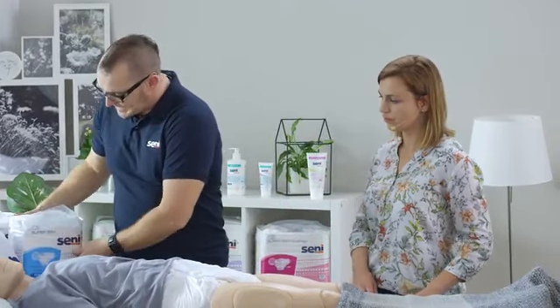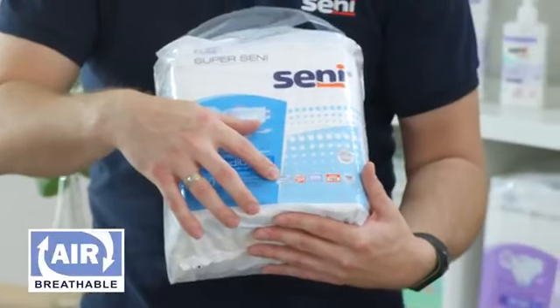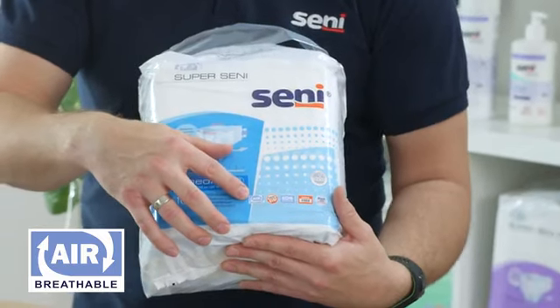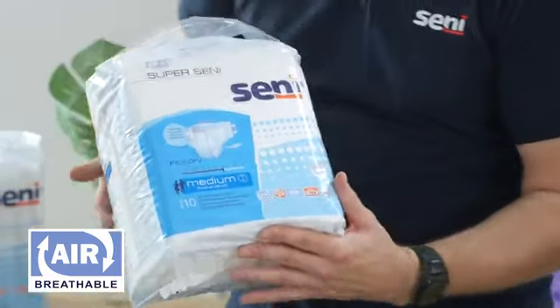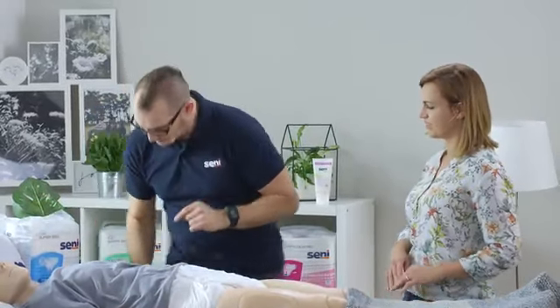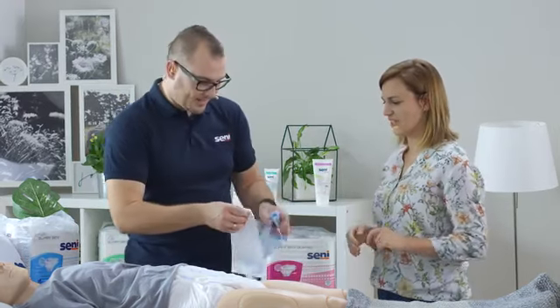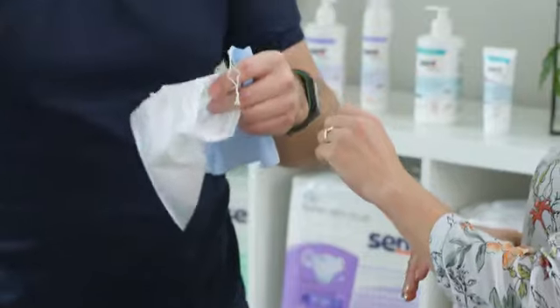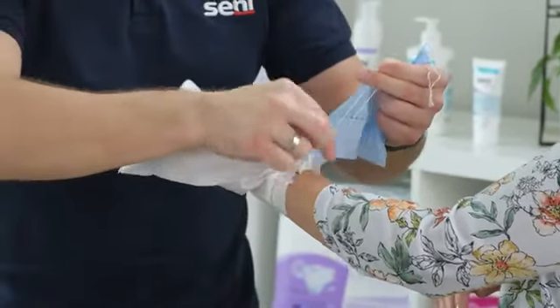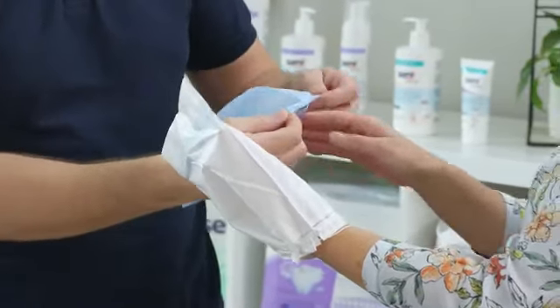In the case of our products, we have a feature called breathability, and I would like to start by telling something about it. This is marked with the word air, or breathability. And now, to clarify, I would like to suggest starting with a small test. I have 2 gloves prepared for you. That means I will be able to feel how it works. That's right. One glove is made of this vapor-permeable laminate, where we have micropores and it allows sweat, excess heat to be evaporated outside. And here I have a traditional foil glove.